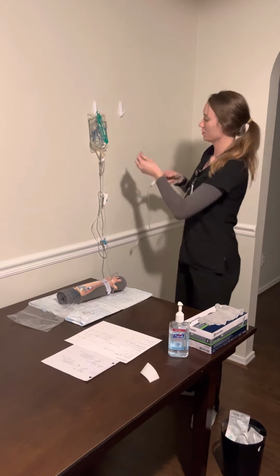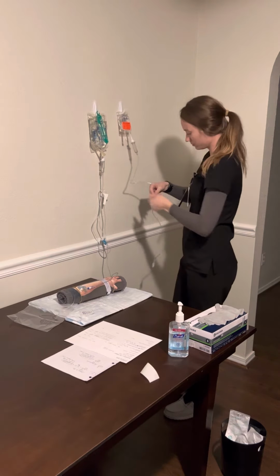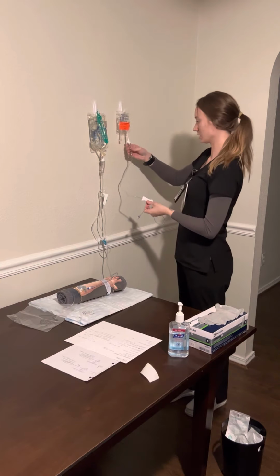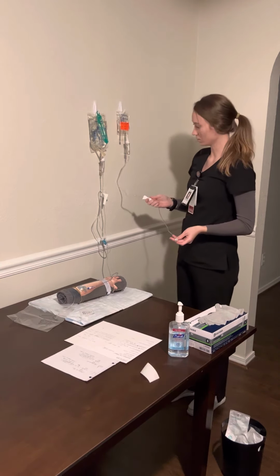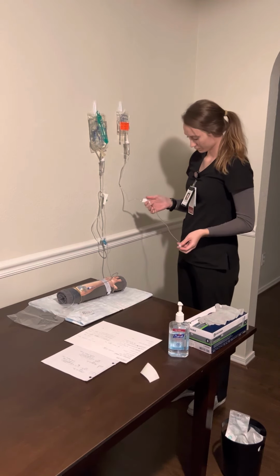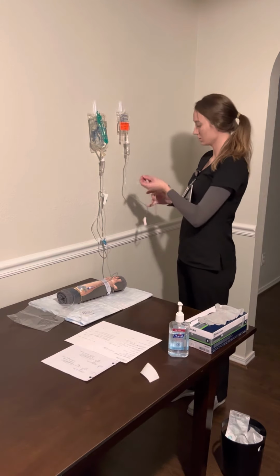Okay, going to hang that. And then we're going to squeeze my drip chamber to at least half full, and then prime this tubing as well, ensuring there's no air in the line. Alright, so that looks good.